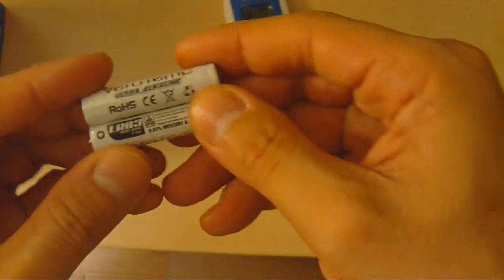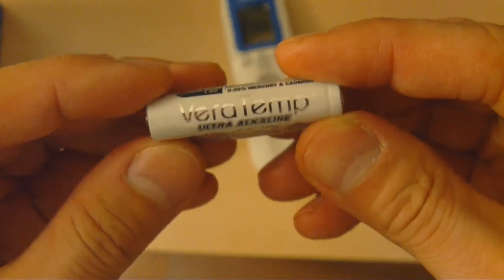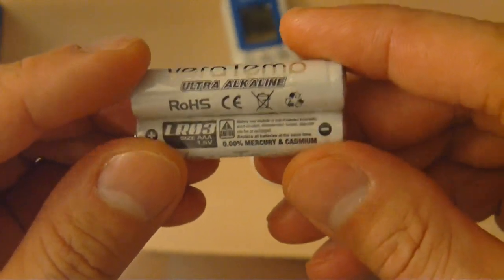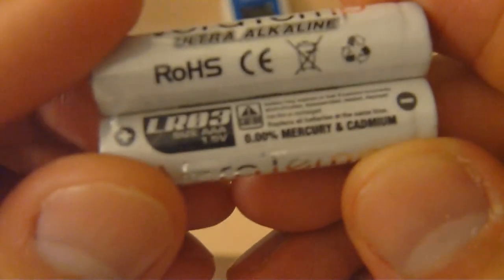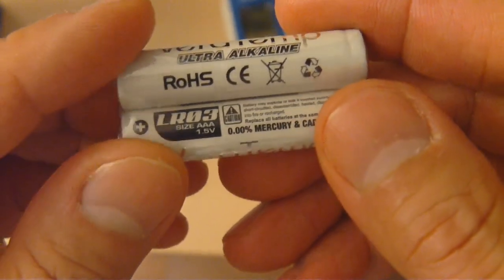The two AAA batteries are interestingly named Vera Temp — ultra alkaline batteries. The good thing is they're zero percent mercury and cadmium free, but probably any alkaline AAA batteries would work fine.